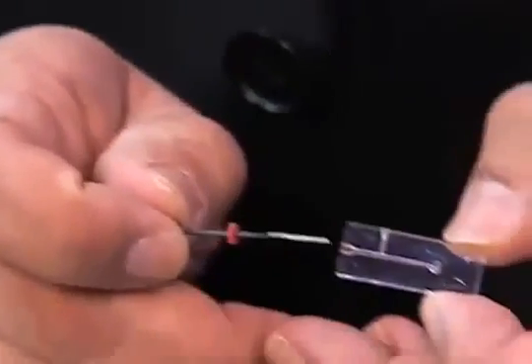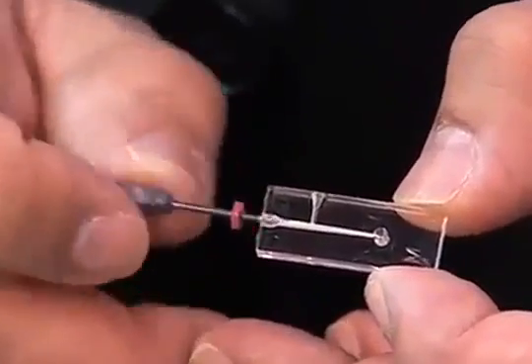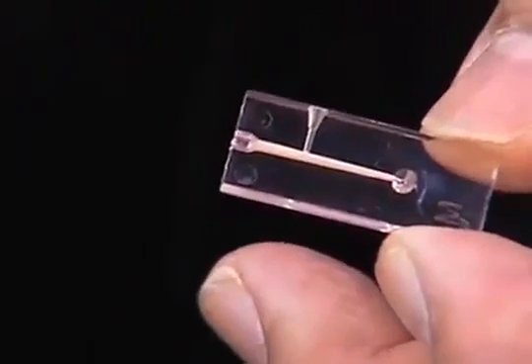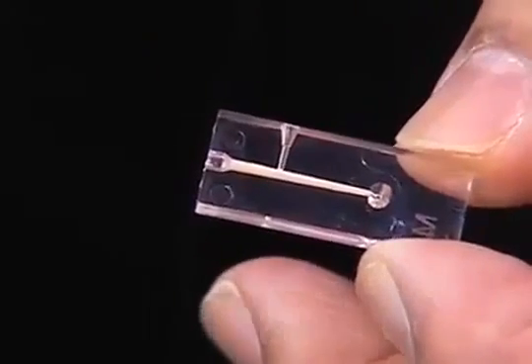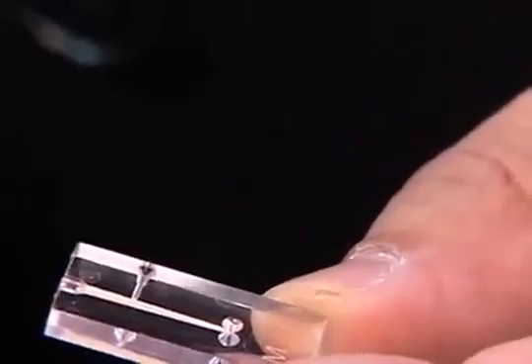For example, I'm going to just take this verifier here and I'm just going to coat the inside of the canal with just enough cement to coat the walls. You do not need to put excess in or too much in. All we want to do is to coat the walls of the canal space.